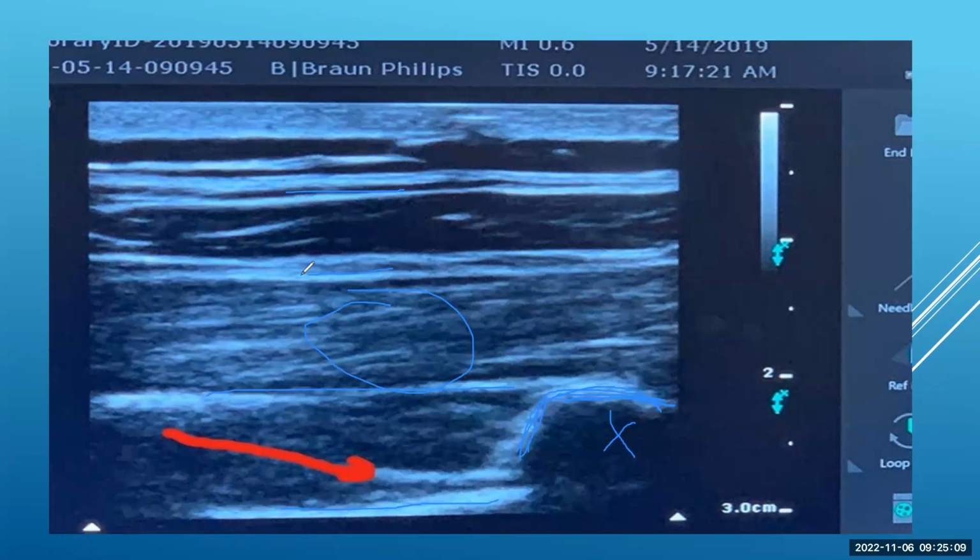So you can see how ultrasound has very much revolutionized the paravertebral business, because when you place your needle and your trajectory is like such, and you have to puncture through the costotransverse ligament, but you don't want to puncture the pleura. We inject local anesthetic all in this area, and you can see how the incidence of pneumothorax has been decreased related to just accuracy of placing the needle.